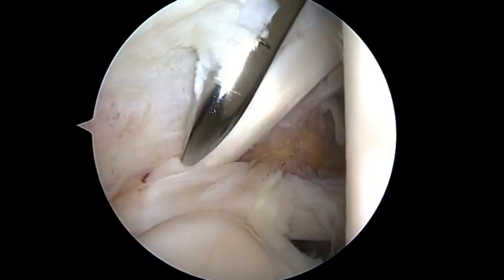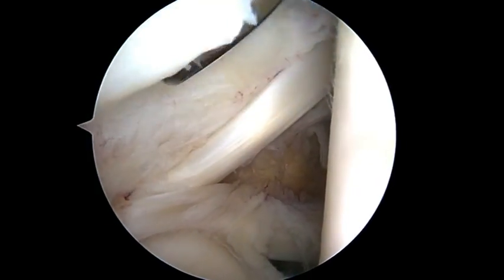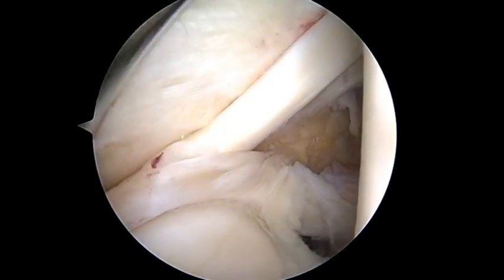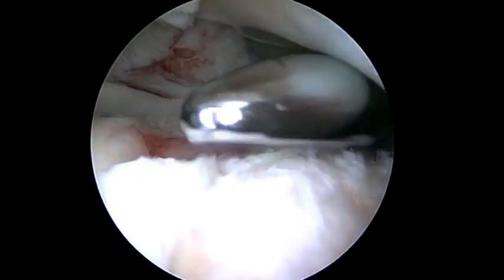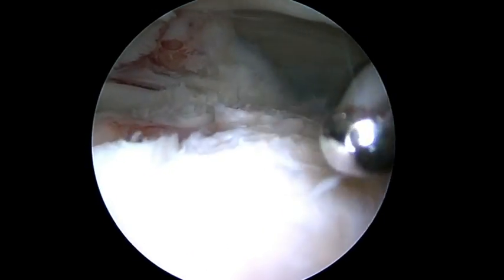The tapered tip makes it easy to move around the shoulder and, again, in all the little crevices that you would need to do. We're now going to move to the greater tuberosity, where you can see it evenly. It takes a nice small area of bone.